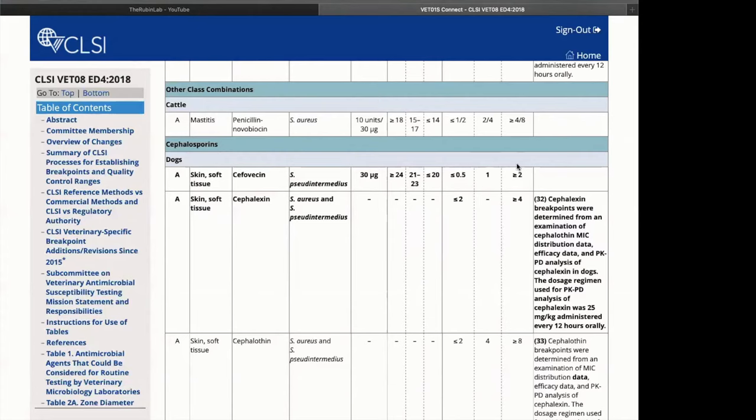Similarly, just to the right, we have our MIC interpretive criteria, where an MIC of less than or equal to 0.5 would be considered susceptible, 1 intermediate, and greater than or equal to 2 resistant.